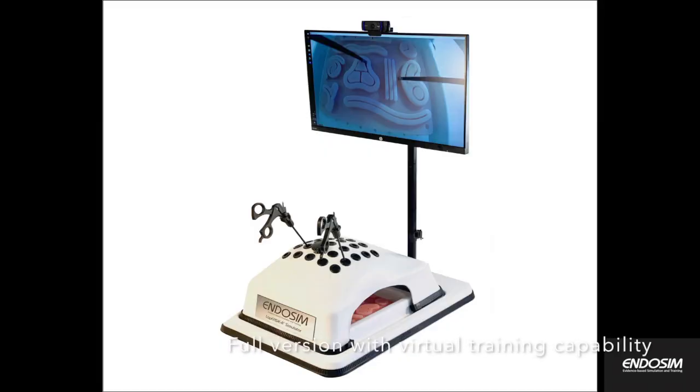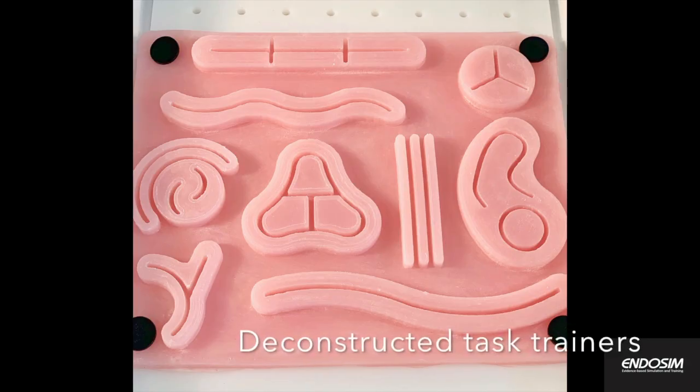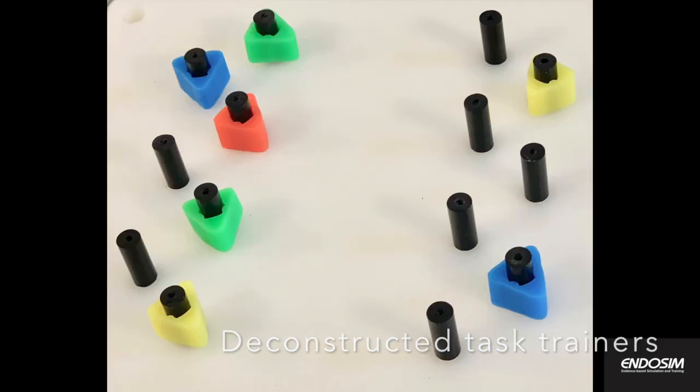The simulator package includes a series of task trainers such as a suturing pad, bead transfer module, pegboard with triangles, and a ring transfer module.